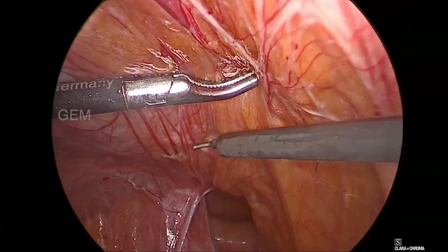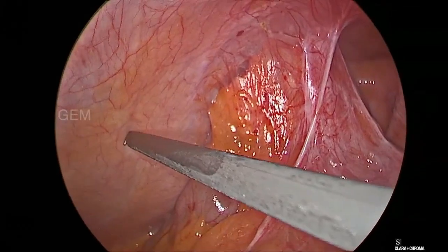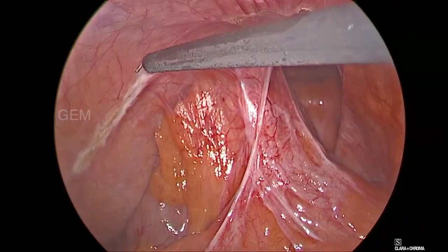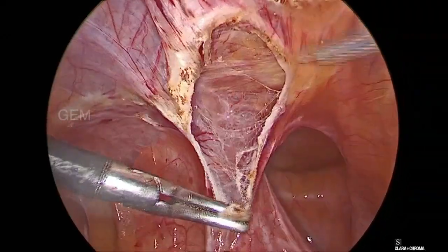The sigmoid colon adhesion need not be released. We are marking the incision from ASIS to the lateral umbilical ligament. We usually prefer to take around two to three centimeters above the hernia defect.